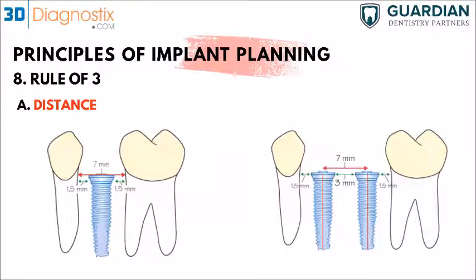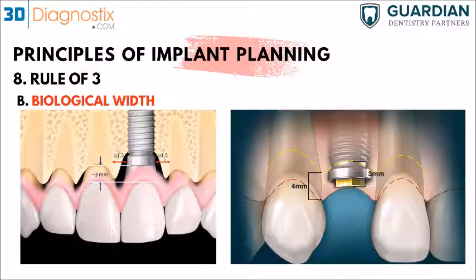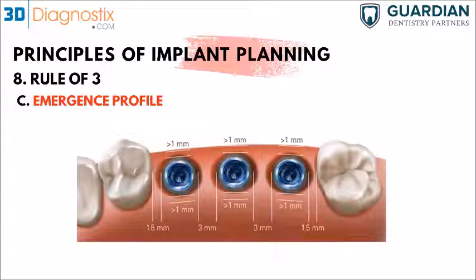On the right side, if you're placing multiple implants, more than one, then you need to make sure that 3 millimeters is the least distance you should have between those implants to prevent any vertical bone loss, and also maintain 1.5 millimeters on each side. So that would be 3 millimeters and 3 millimeters as well. Then, of course, to maintain the biologic width, especially for the aesthetic zone, you would need to have 3 millimeters from the platform to the free gingival margin or the CEJ of the adjacent tooth. And for the emergence profile, also at least 1.5 millimeters on the mesial and on the distal between the neck of the implant and the adjacent tooth to have a good emergence profile.